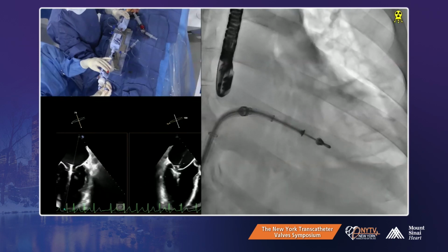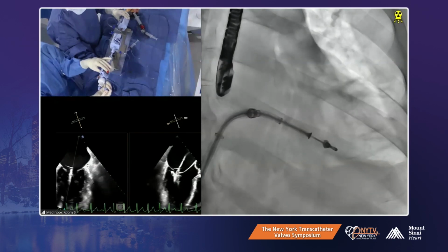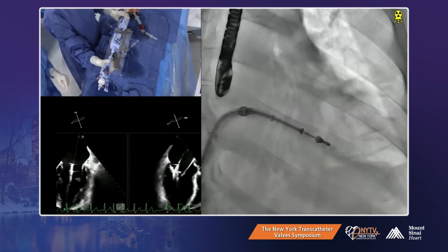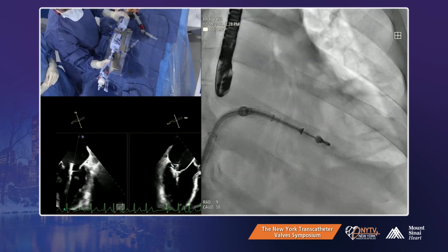Looking better. See how the anterior arm is still a little bit foreshortened relative to the posterior arm? That makes me think you're still a little bit off the prolapsed area of the anterior.